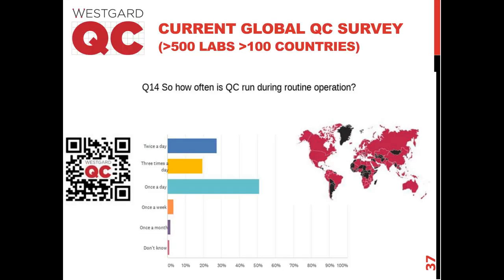When we match that up with the global trends, we see 27%, again, almost a quarter, twice a day. Just a slim majority, similar to your answers, are running once a day, and a little under 20% are running 3 times a day. And thankfully, only 1.6%, and mostly those are point of care users, are lunatics.